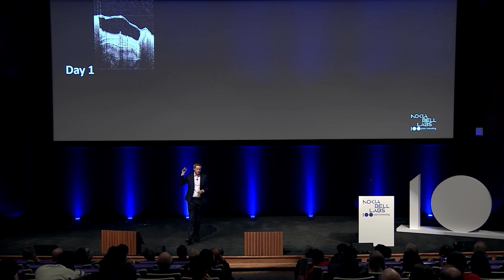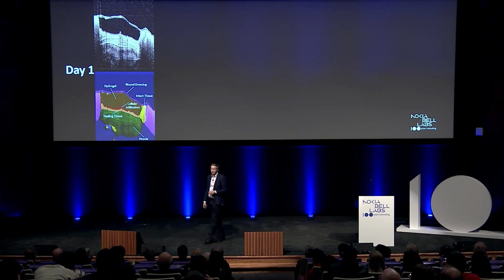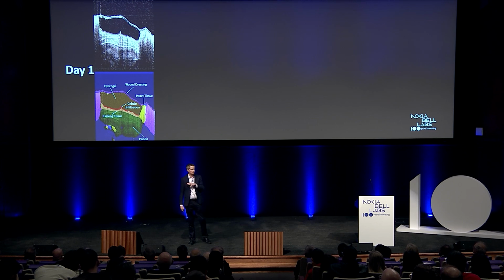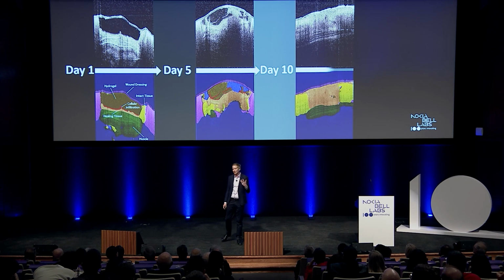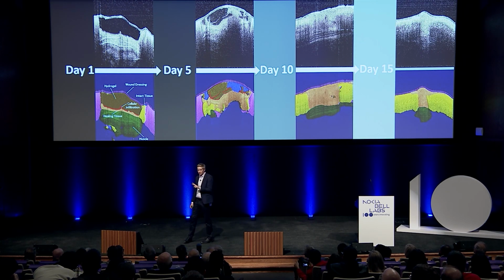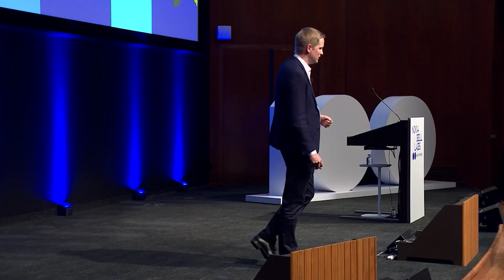And so what we're able to do is take OCT, and this is a scan of a live mouse. They have an incisional wound, and we're actually able to take 3D scans of that entire wound area. We can then feed that into an AI model, which then segments out all of the important structures within the wound, and we can now non-invasively watch as this wound heals over days and weeks. And so what's cool here is we can actually do two things. One is we can detect when things are starting to go wrong days or more before a typical clinician would be able to see it with their eye. Second of all, we can now actually see the mechanisms by which the wound is healing to make better treatments. So this is just another exciting area we're looking at with OCT.